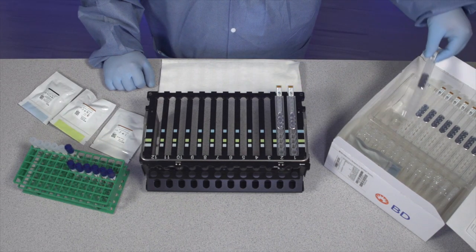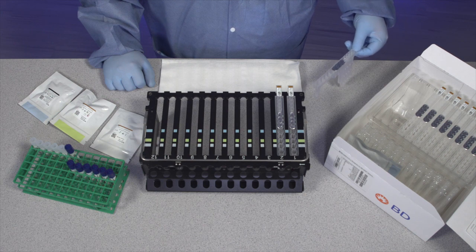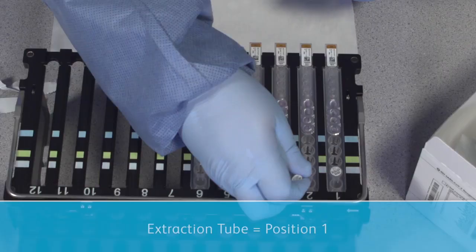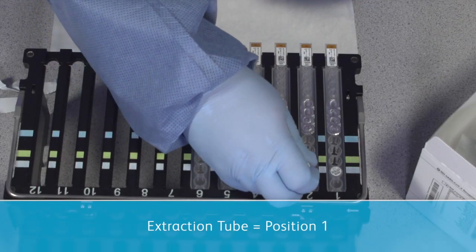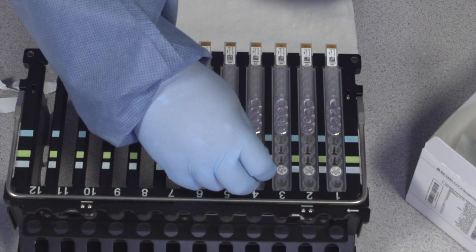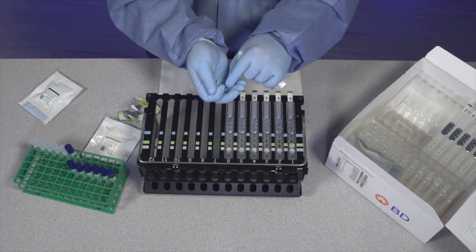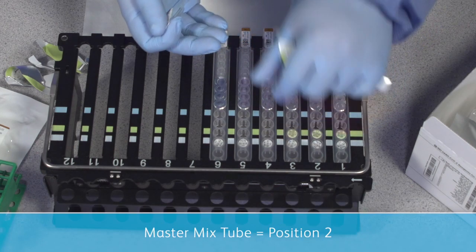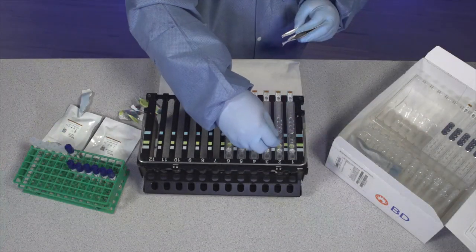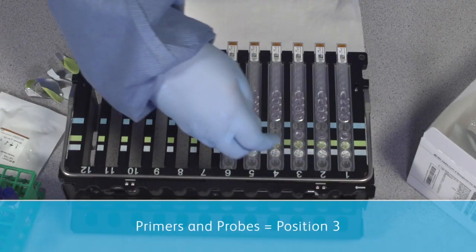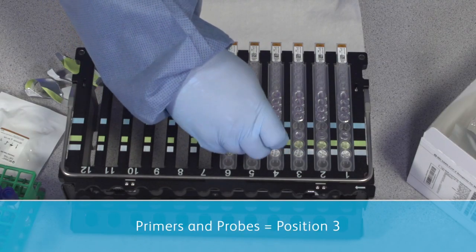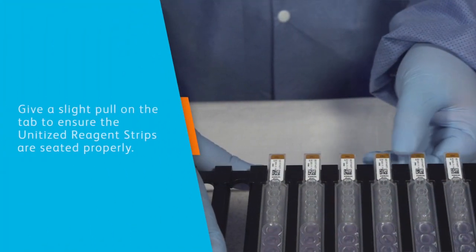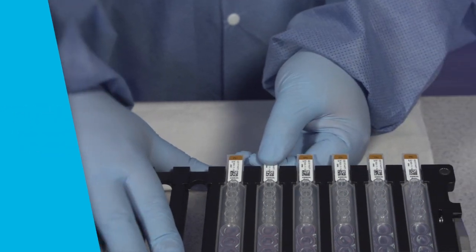For each specimen to be tested, place one unitized reagent strip on the BD-Max system rack. Assemble the strip by snapping the BD-Max EXK TNA-3 extraction tube into position one. Snap the BD-Max TNA-MMK master mix tube into position two. Snap the BD-SARS CoV-2 reagents for BD-Max system primers and probes into position three. Leave position four empty. As a tip, give a slight pull on the tab to ensure the unitized reagent strips are seated properly.